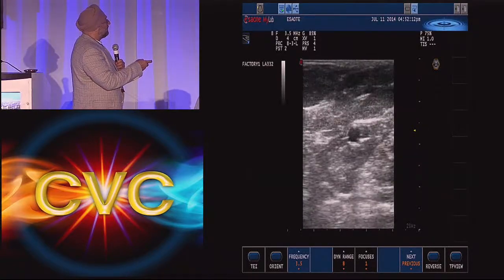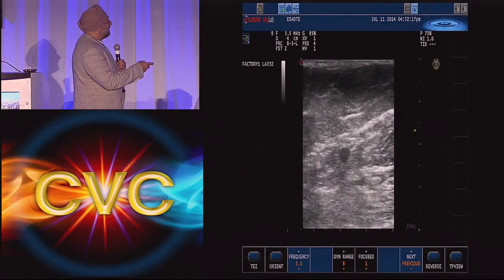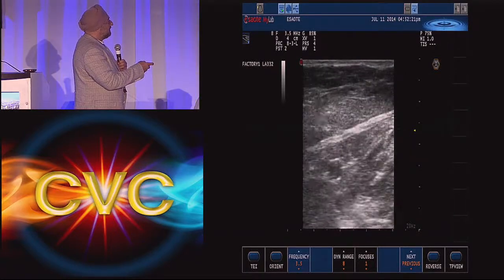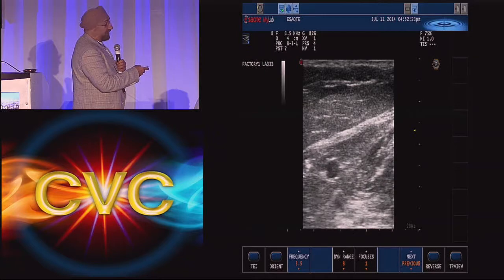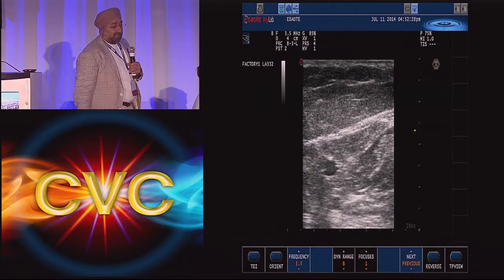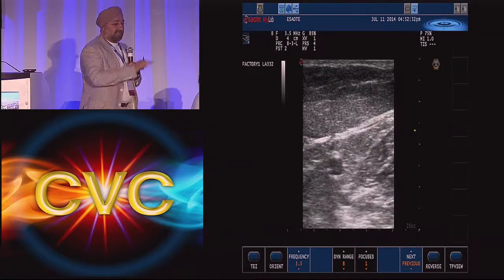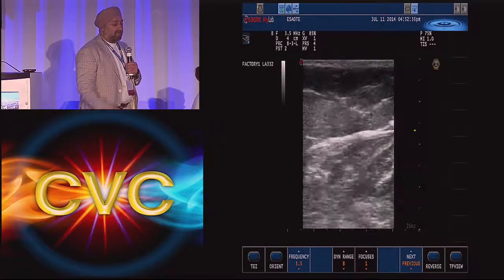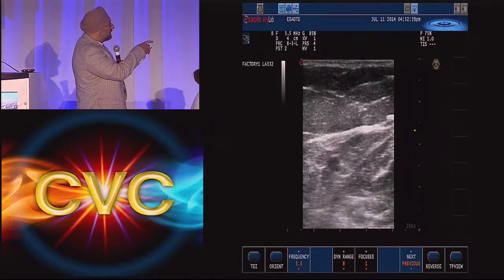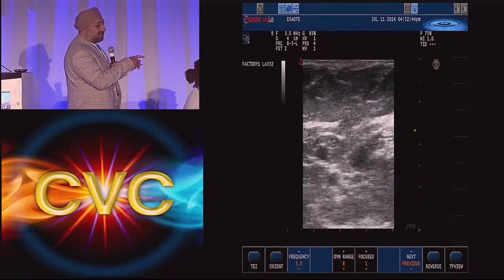Past the popliteal fossa. Are you going to the vein of Giacomini, or did it not dive down? I didn't see that. Okay, so she's all the way up at the back of the thigh. Sometimes the lesser saphenous will just extend up, and then there's the vein of Giacomini that comes up all the way and connects up to the greater saphenous. It's an intercommunicating branch. So it's very important to recognize some of these patterns, because you would normally expect that to dive in and catch up with the popliteal. In this case, it wasn't doing that.